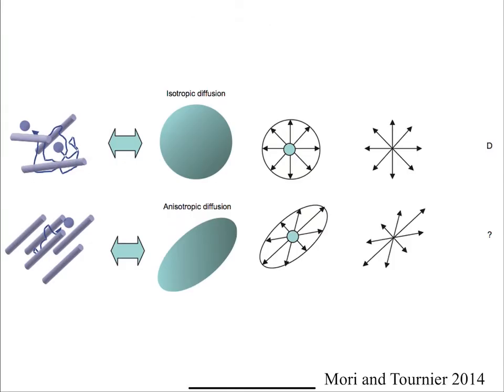The other main application of diffusion is comparing whether diffusion is isotropic or anisotropic. So the idea is, if I have a tube, it's much easier for the water to diffuse along the direction of the tube than it is to diffuse across it, okay? Because it's going to hit the boundaries, and so it can't really go beyond them. So we have a lot of tube-like structures in the body, and one of the main ones is all the white matter fibers in your brain, which are like fibers that go quite long distances sometimes.